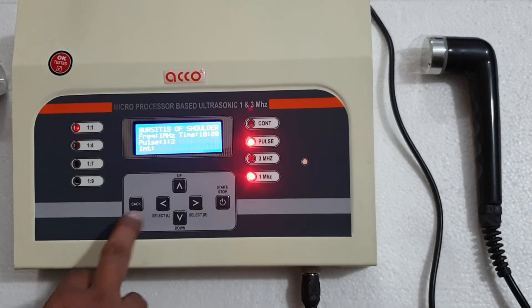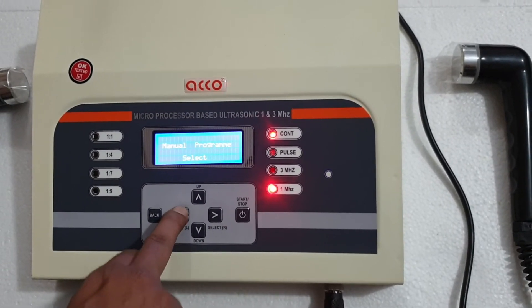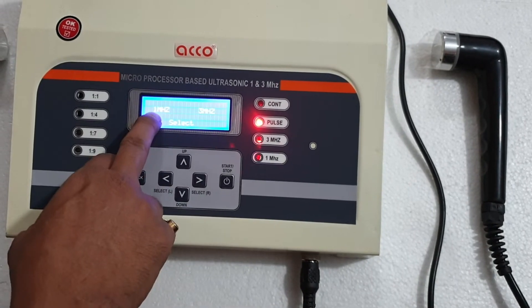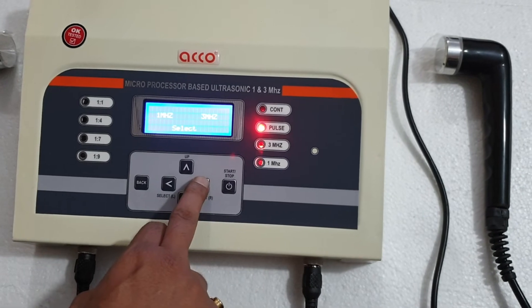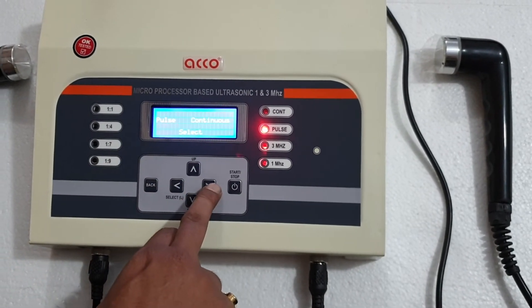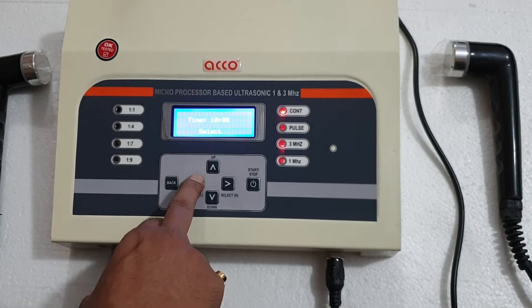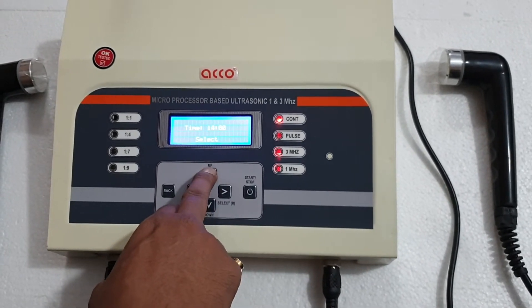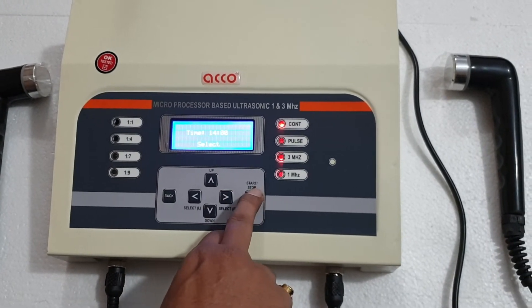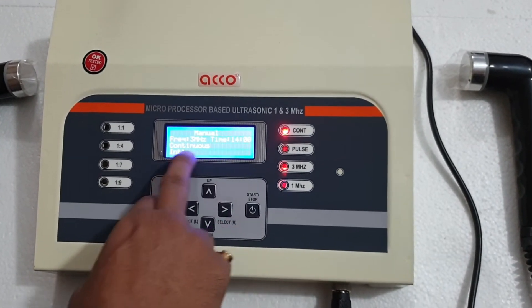Now we will show you how to set the machine on manual mode. Select manual and program — you have to select from the left. Now you want to set 1 megahertz or 3 megahertz — we'll select 3 megahertz. You can select continuous or pulse; we will go for continuous. For time, you can increase or decrease: timer up, timer down, then select. Press start. Now it shows a manual program: frequency 3 megahertz, time 14 minutes, on continuous mode.